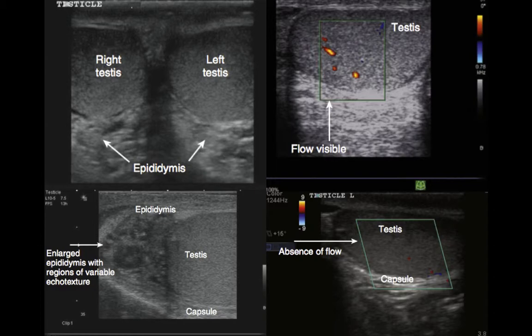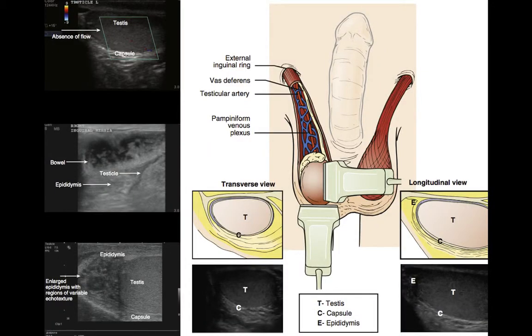If the scrotum is painful, you should be aware that this pain may be caused by testicular torsion. We scan in the longitudinal way and transverse way, and it is even better to compare each side with the other. In this kind of emergency situation, testicular torsion, you need to turn on the flow. And sometimes you will observe a swollen scrotum because of bowel loops dropping into the scrotum. Sometimes the problem is caused by enlargement or inflammation of the epididymis or even the testicles.